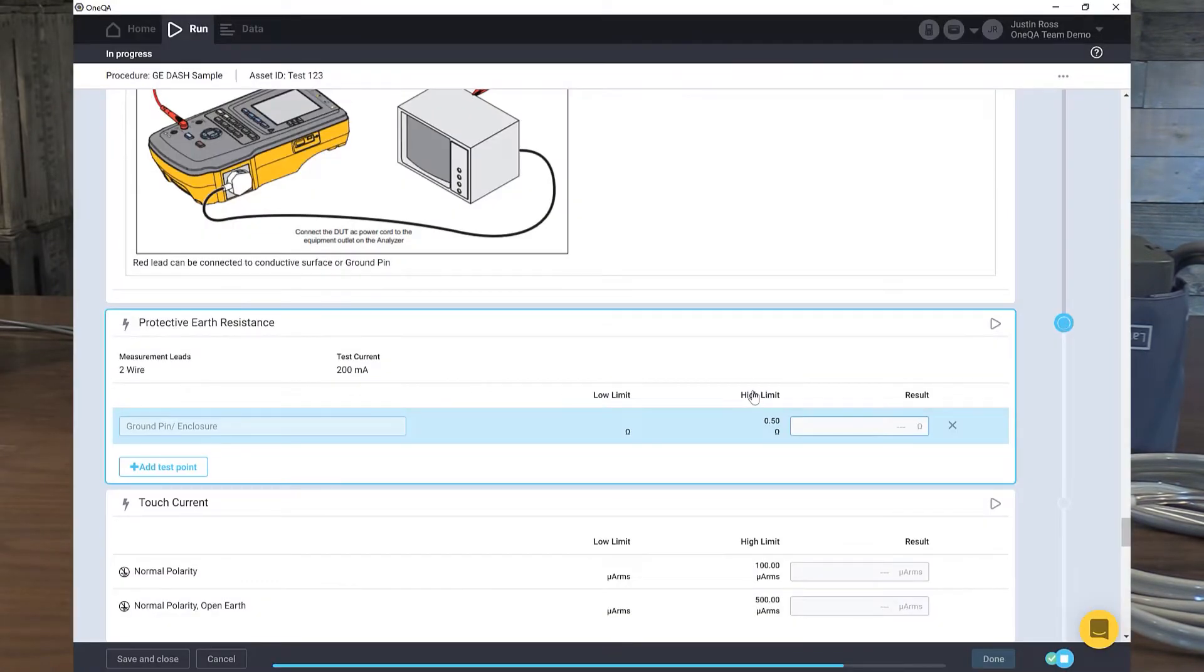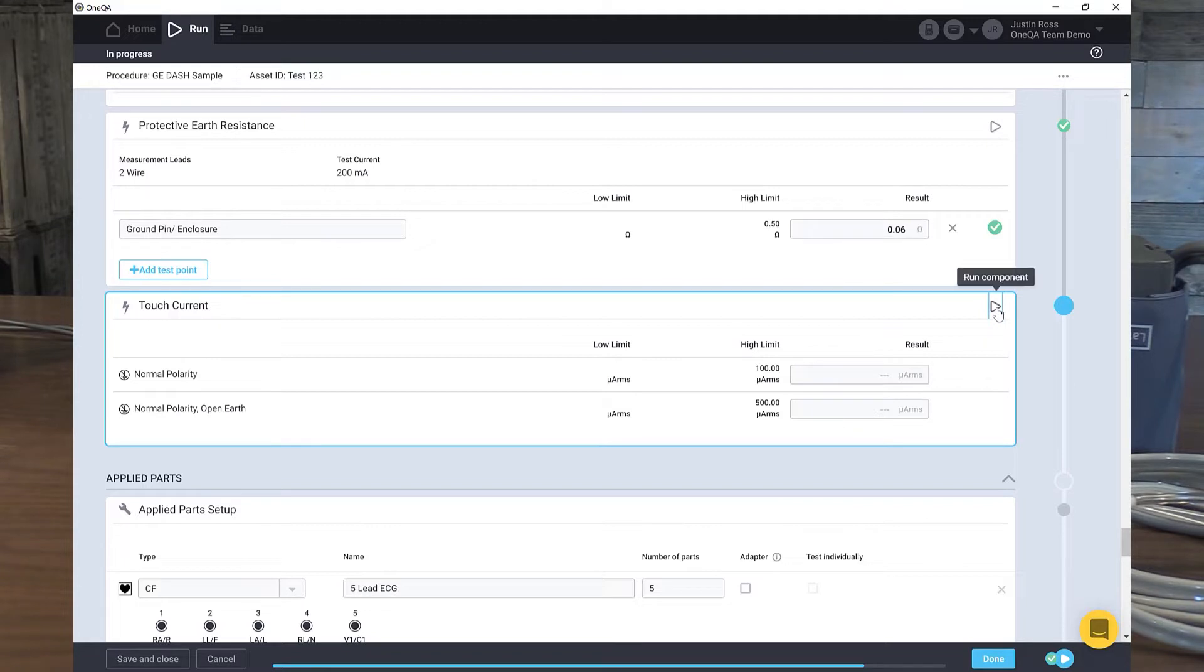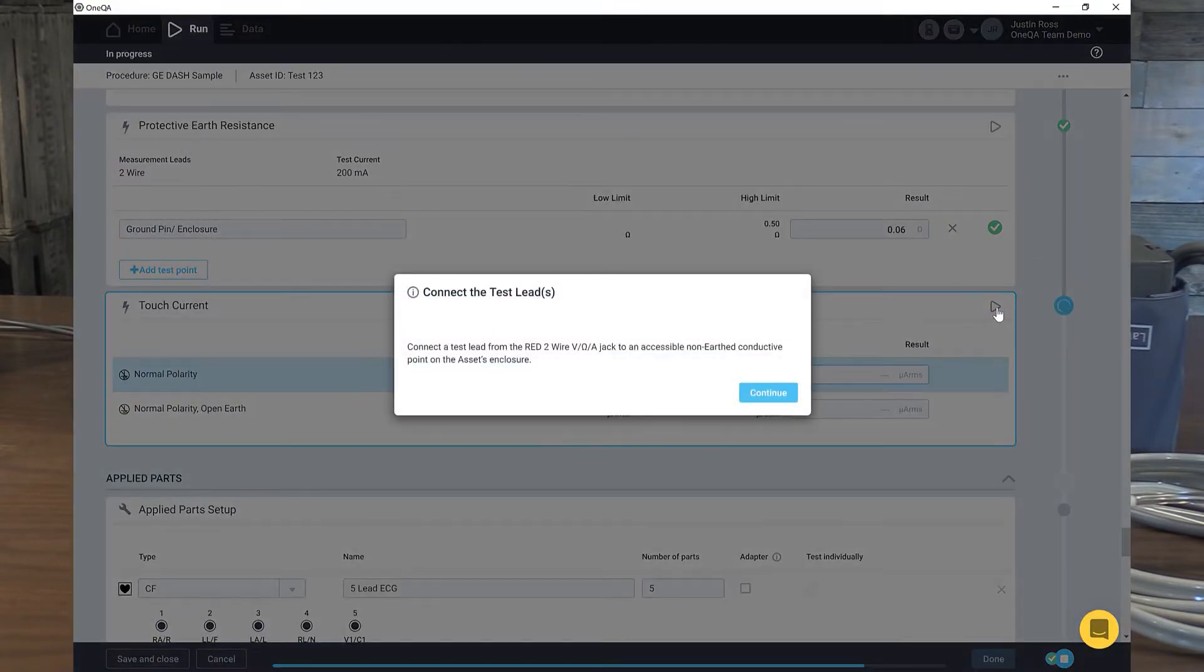Again, this might not be the way you do electrical safety. This is just an example. You see it automatically generated a resistance. Push run on the next one. Continue.